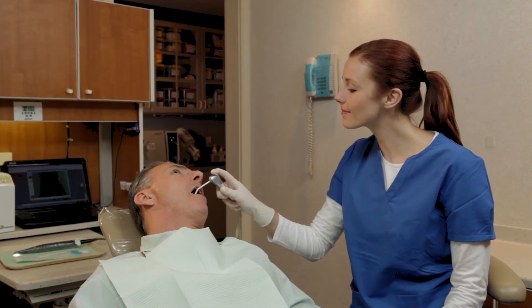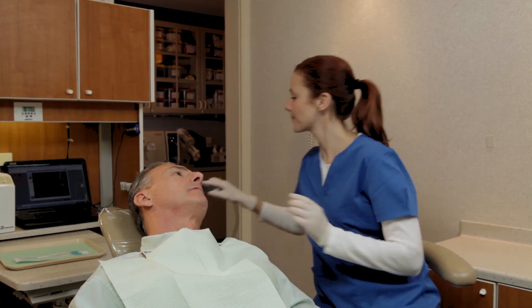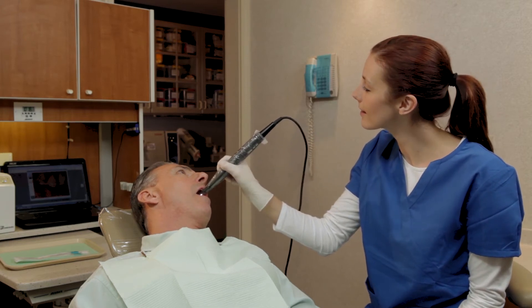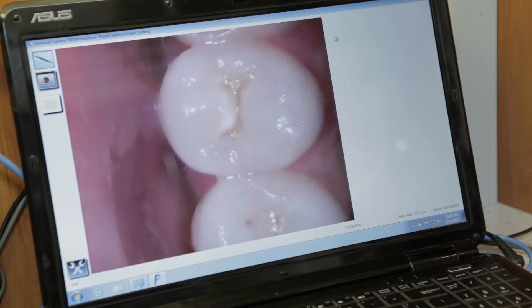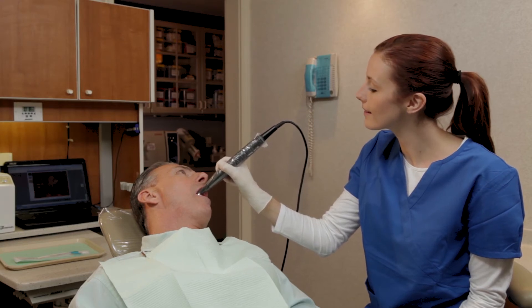The teeth need to be dry and free of organic debris. To capture an image, depress and hold the Capture Upon Release button. Adjust the position of the camera to zoom in or out until you have the image within the monitor's screen. Then simply release the button to capture the image.